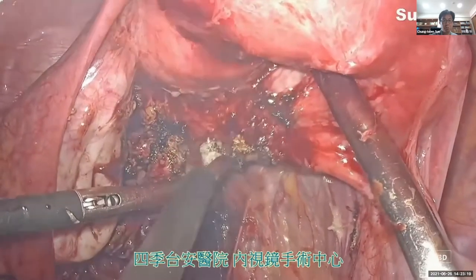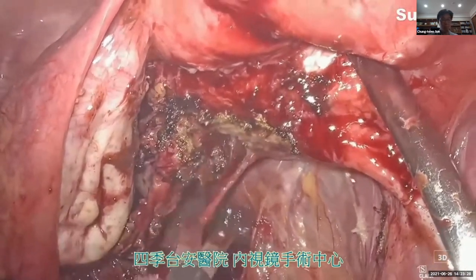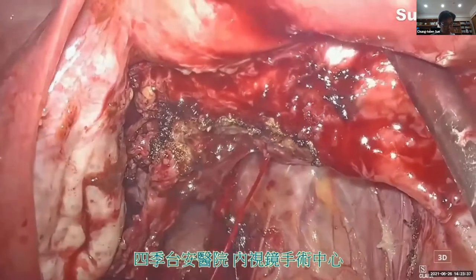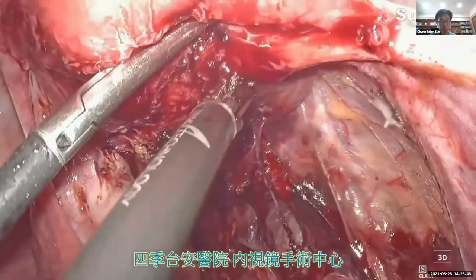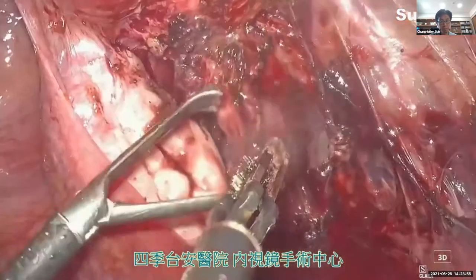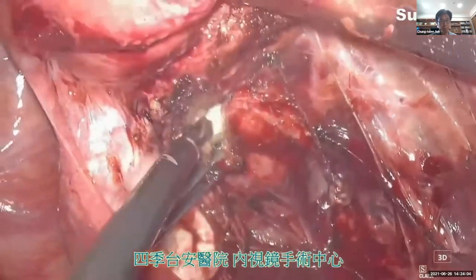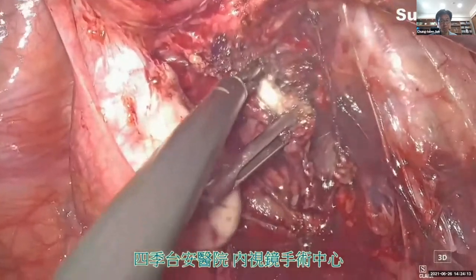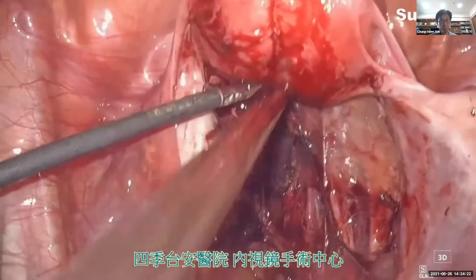Now we are shaving the DIE lesions over the posterior uterine wall, or the so-called torus uterinus, down to the retrocervix area. We are getting very close to the right uterine vessels, as you can see here. Now we continue to excise the DIE lesions over the torus uterinus. We suspend the uterus to make the uterus more antiverted.